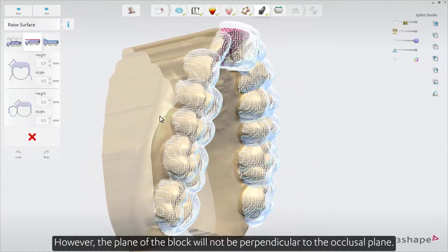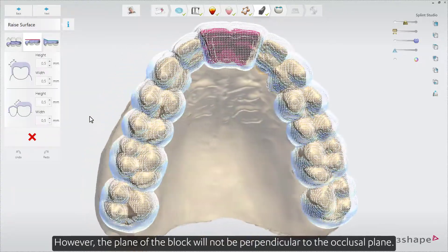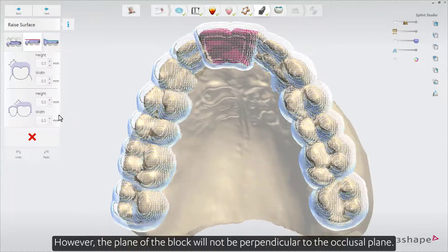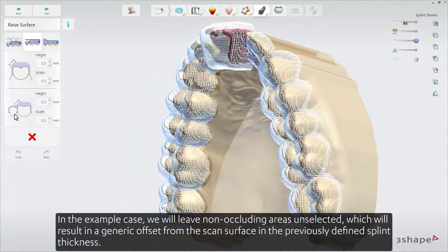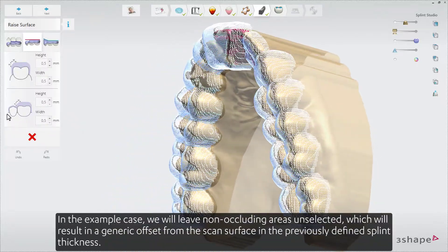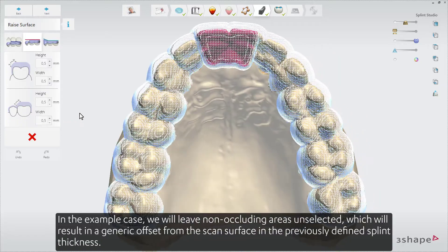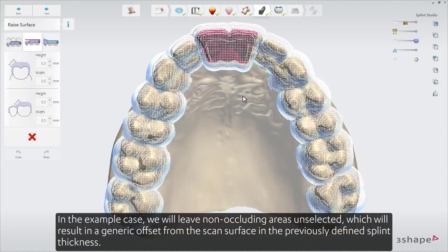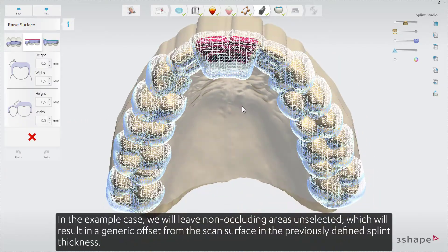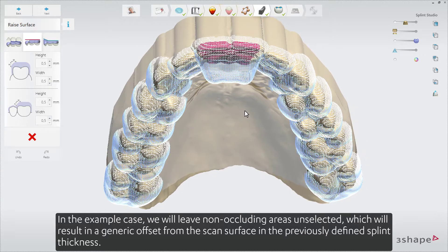However, the plane of the block will not be perpendicular to the occlusal plane. In the example case, we'll leave non-occluding areas unselected, which will result in a generic offset from the scanned surface in the previously defined splint thickness.